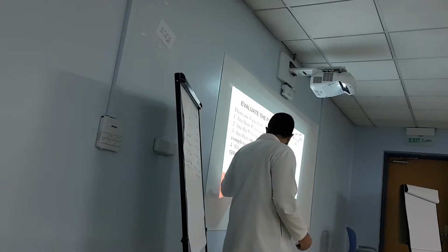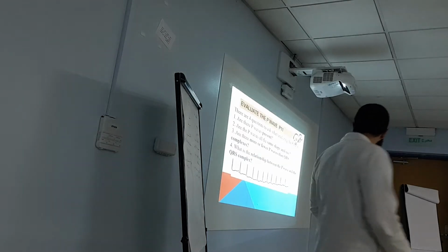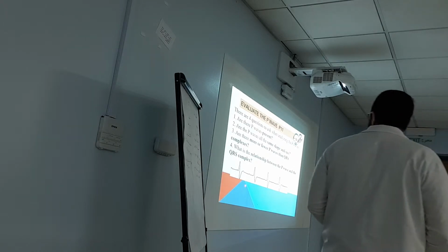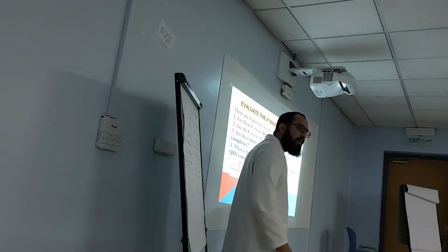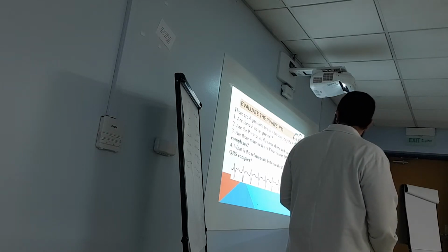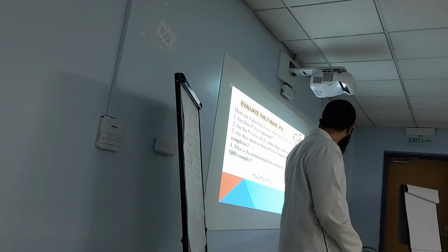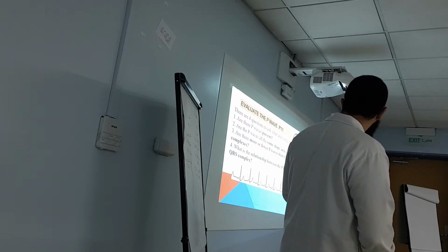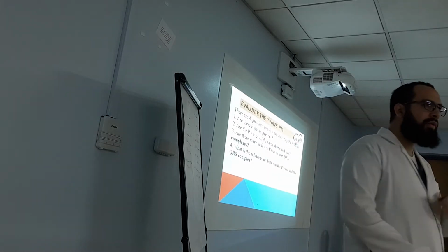Here, for example, you see sometimes there is a P wave and other times it is absent, okay? So here it is absent. Here, the P wave does not come before the QRS, it comes before and after and even on top of the QRS. And here, also we can see absent P waves. This one is a T wave, not a P wave. Here you can see it present, before the QRS, in the same direction as the QRS, and only one P wave before each QRS.